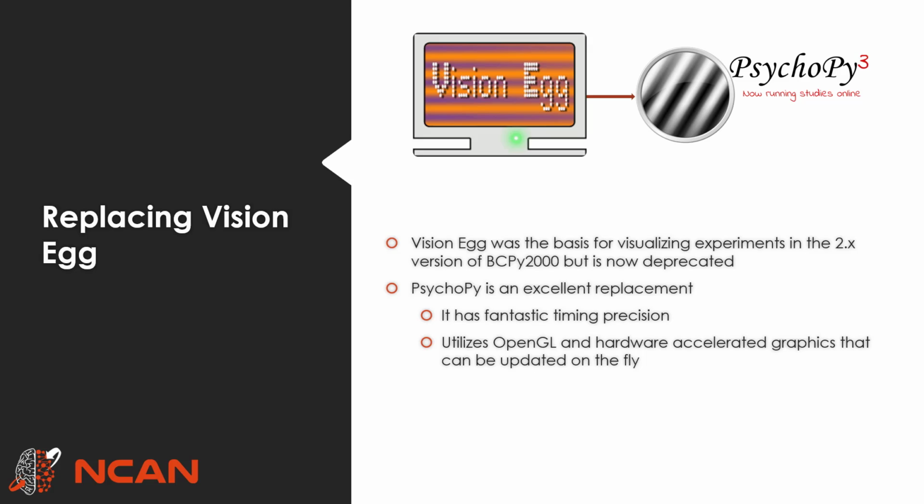It has a bunch of tools and features which allow it to be lightweight and precise, and it's very accessible to a lot of neuroscientists and even undergraduate psychology students, as it has a built-in GUI builder, dynamic stimuli, and a wide range of supported hardware such as an eye tracker, buttons, and trigger systems.